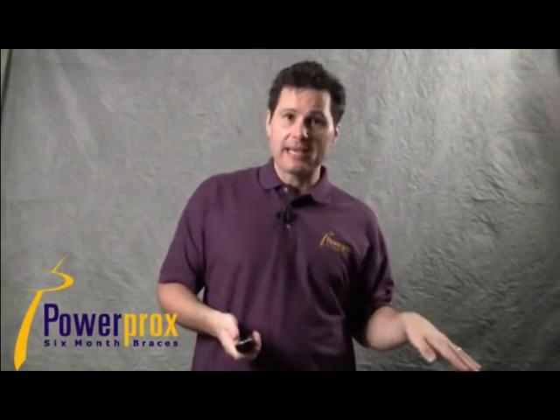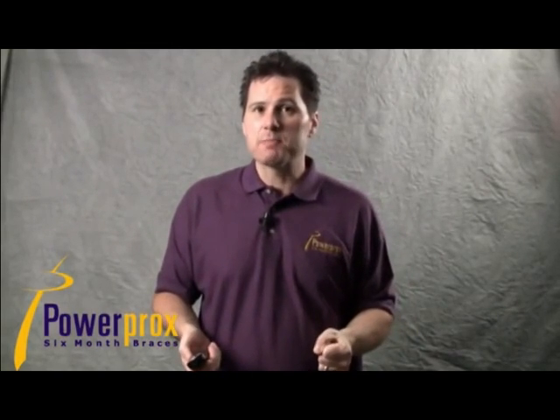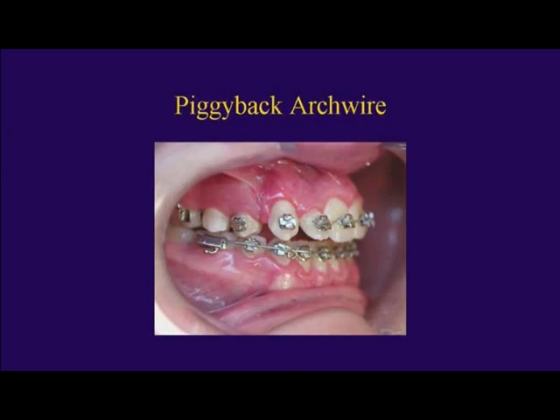And because we're not using a continuous wire, we're not going to have a lot of unwanted side effects on those adjacent teeth, the lateral and first bicuspid. And you can see what happened in just one visit. Okay, so it's a very quick way to do it and very safe way to do it as well.